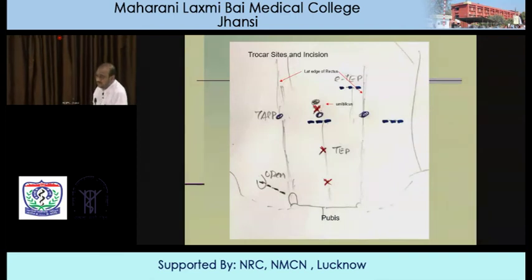Right? Now, you've got a TEP repair, you've got a TAPP repair, or you could be having what is now known as the eTEP repair, or extended TEP repair. Now, this is just the placement of mesh, the core placement.